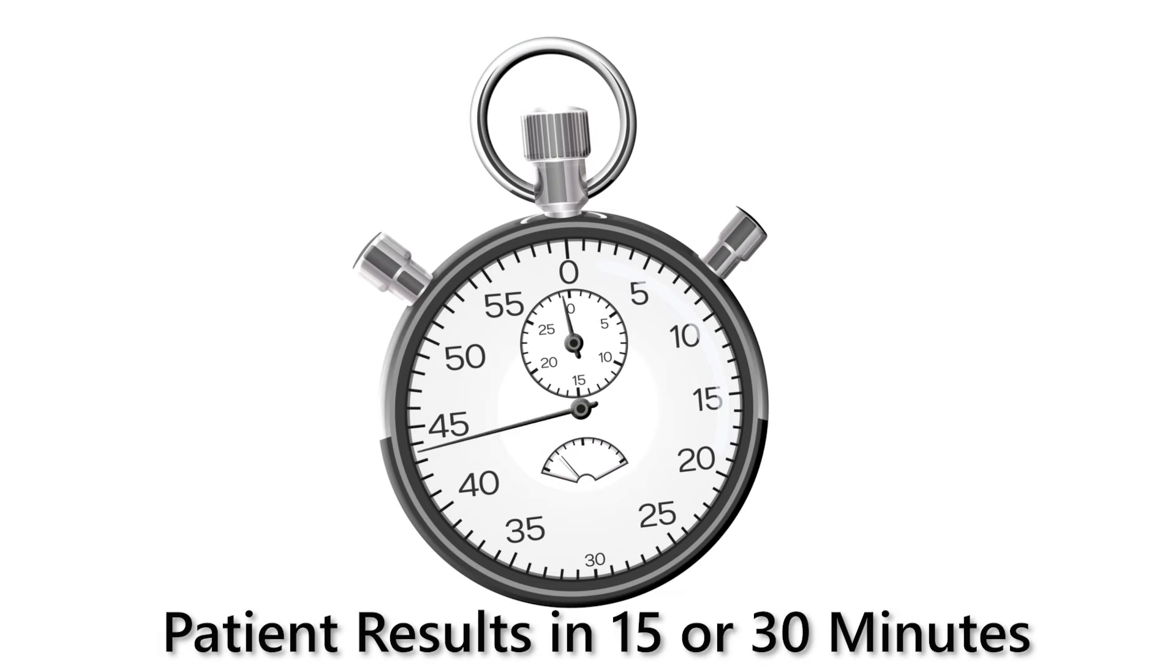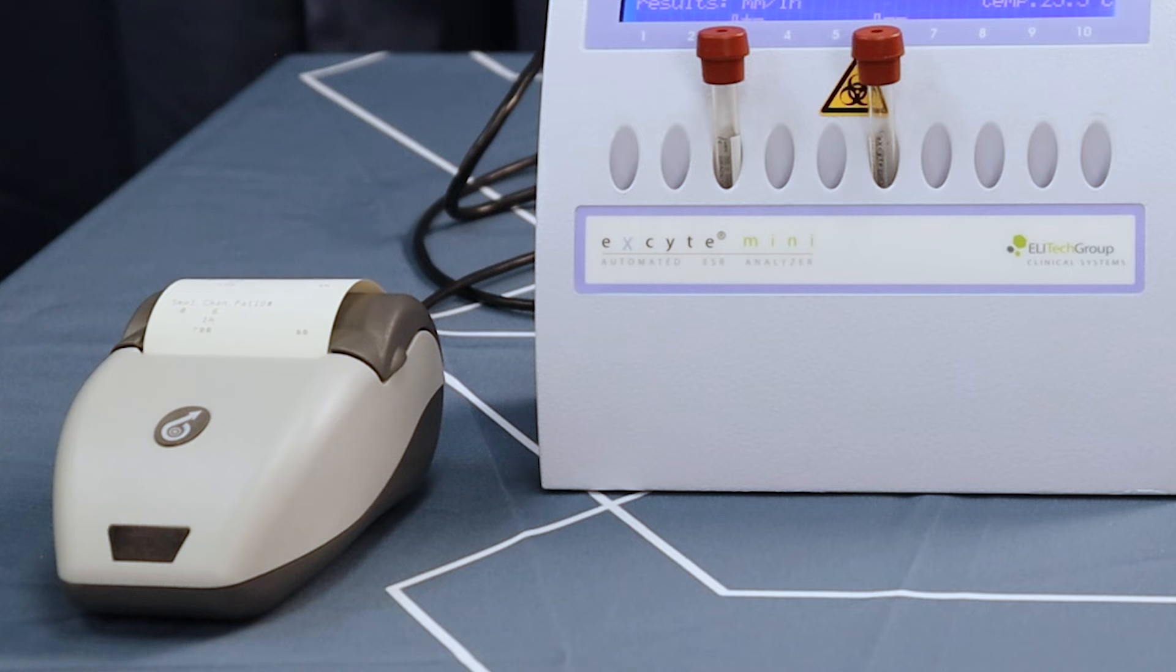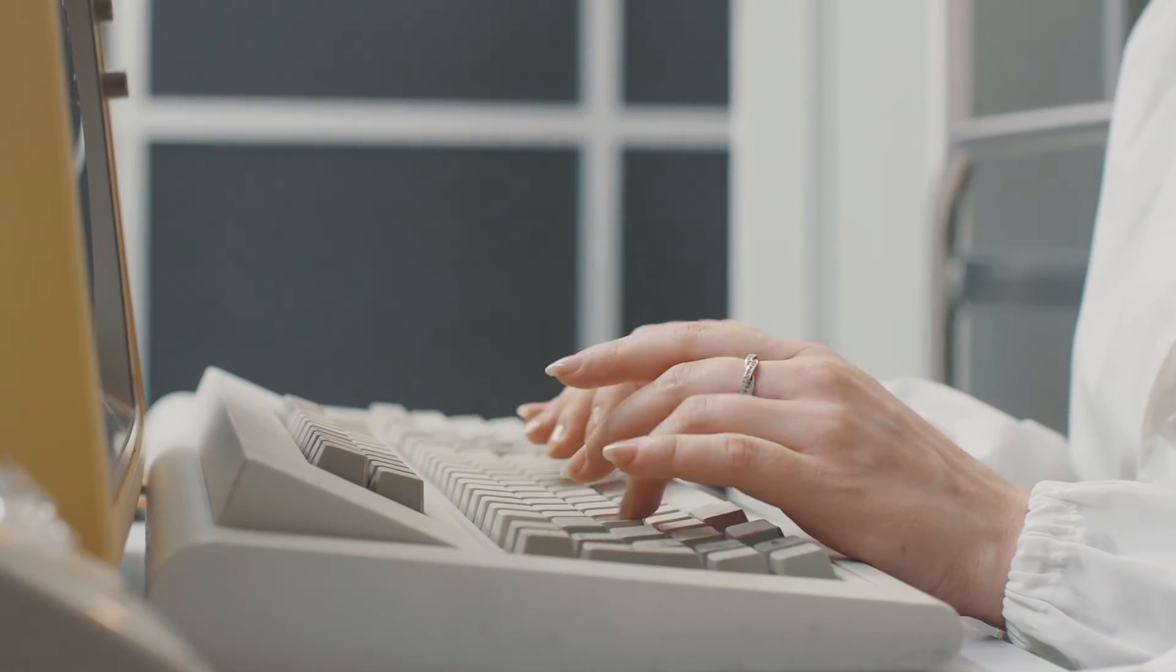The run can be set for either 15 or 30 minutes. Depending on your setup, results will automatically print, and if connected to an LIS, will transmit automatically.